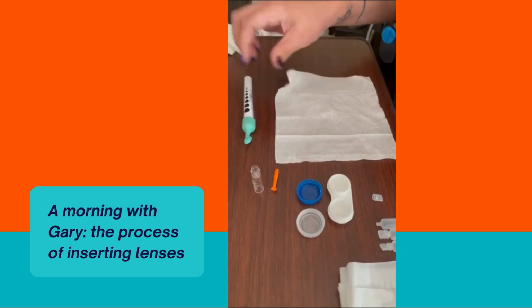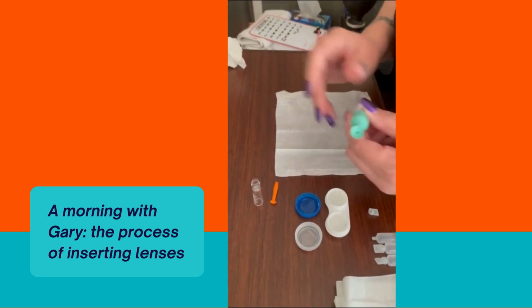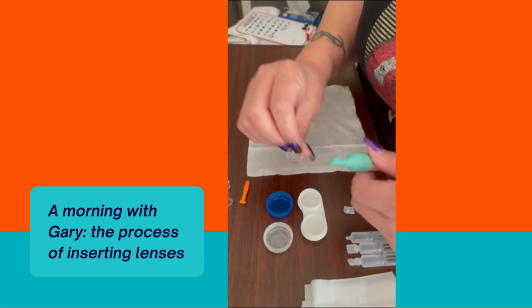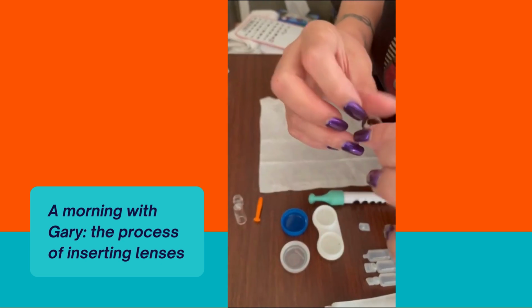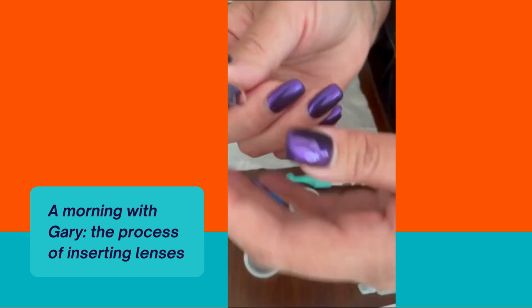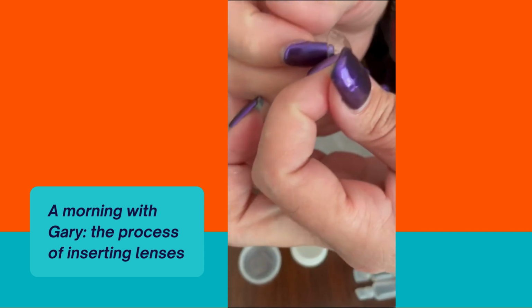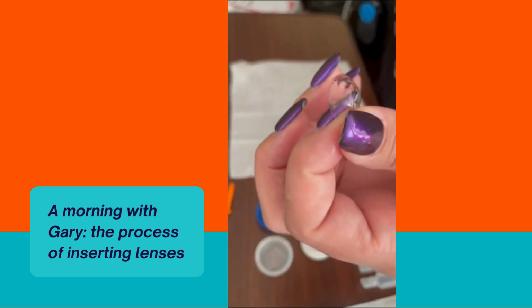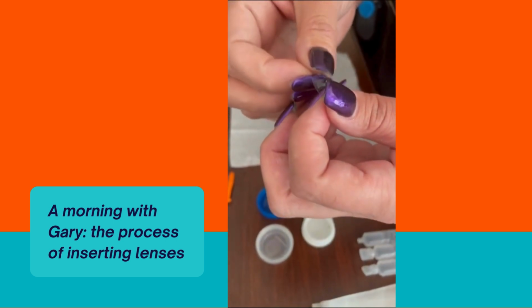So we're just going to start with putting on our first contact. So you want to take the first one out. And that one's going to go in his right eye, and if you look here, let me just find it. It has the single dot. There's one single dot. That's the single dot for the top, right eye, and that signals that it's the right eye, and it also goes to the top of the lid. Yep, so that's going to go on the top.